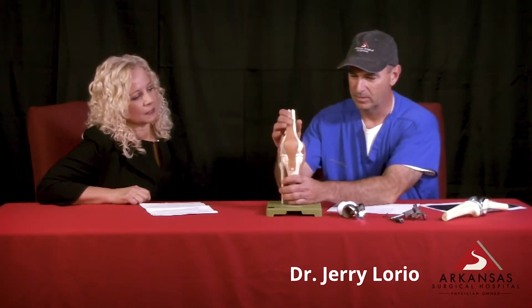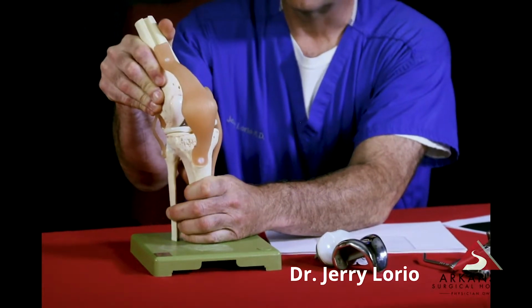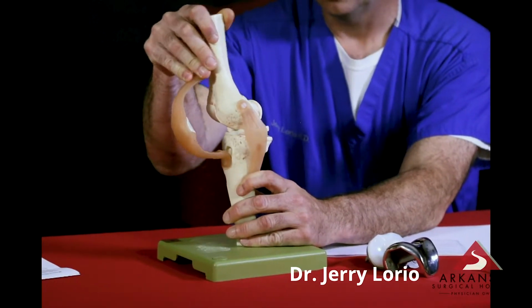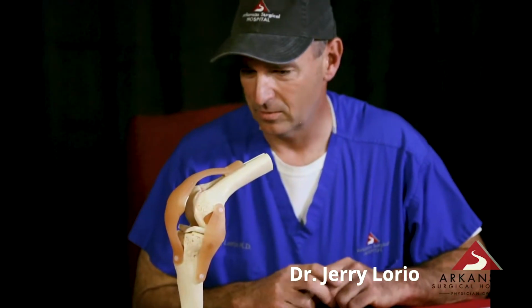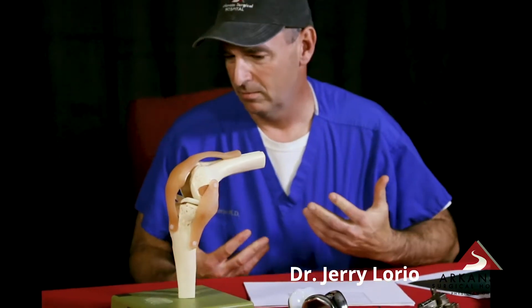Okay. So some knees are real bow-legged, most of them that I see. Some are valgus or knock-kneed. Some have a flexion contracture. Some are hyperextending. And we have an algorithm to customize the cuts across the board so that the knee in the end, we want it straight and able to bend. Usually we can gain 10 degrees of range of motion after surgery than before at the 1-year results.